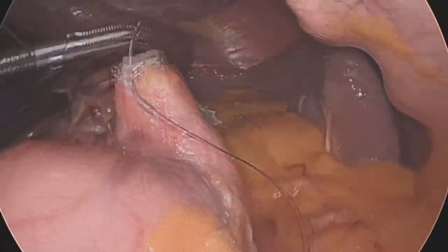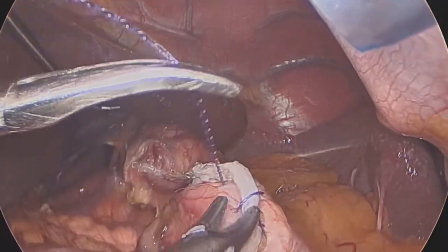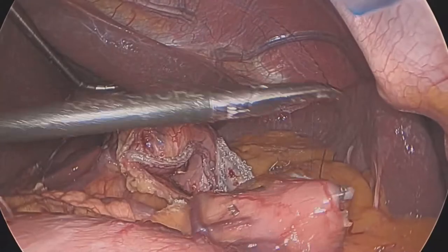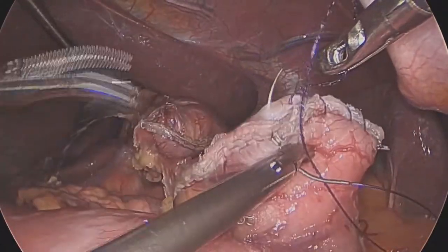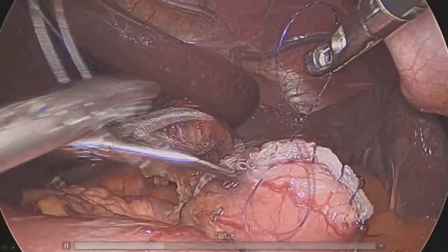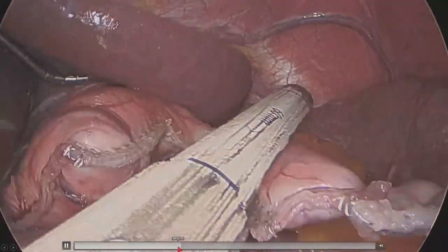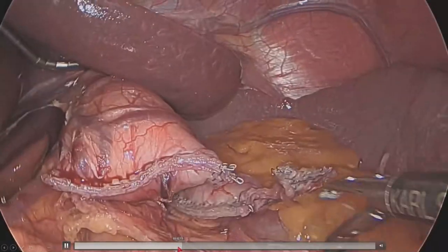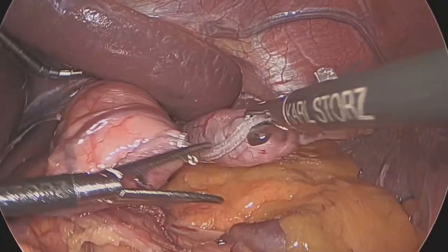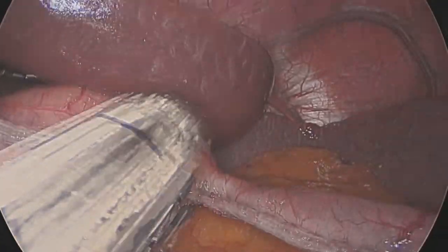Whether the reason for the revision is weight loss or intractable GERD, you have to make the small gastric pouch again, regardless of gastric pouch dilatation. Like this, after transection, making the small gastric pouch is the same as with primary gastric bypass.